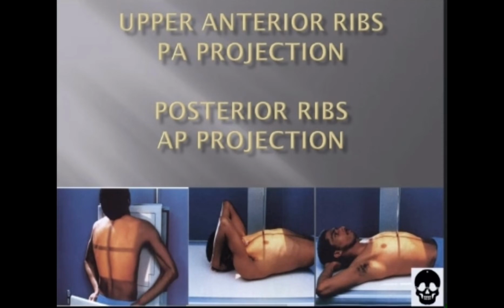Rib fractures can cause a great deal of pain and hemorrhage because of the closely related neurovascular structures. This situation commonly makes it difficult for the patient to breathe deeply for the required radiograph. Deeper inspirations will be attained if the patient fully understands the importance of expanding the lungs and if the exposure is made after the patient takes the second deep breath.